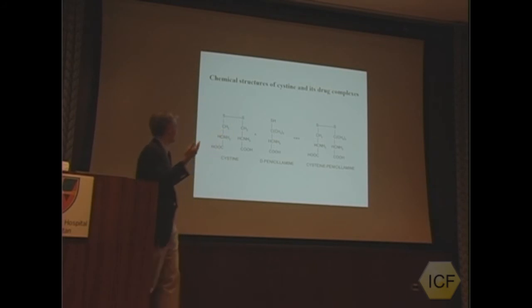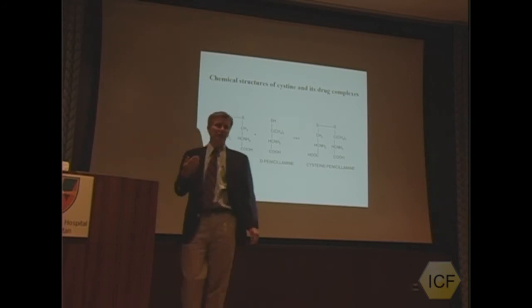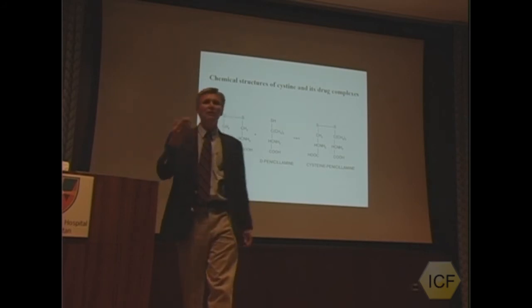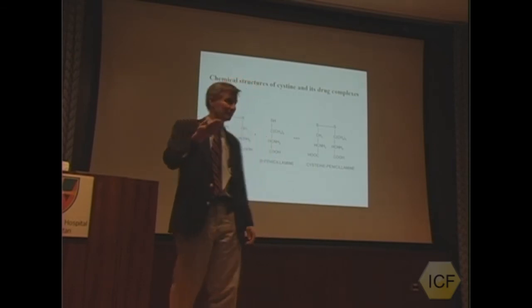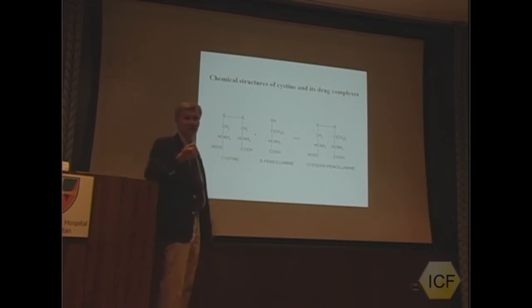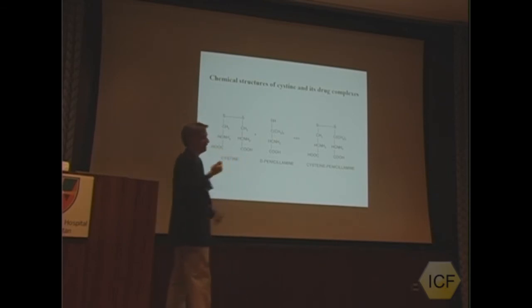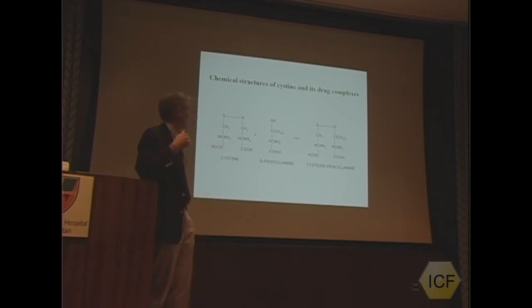You think, well, why are you telling me this? Because if you're measuring the amount of sulfur reactivity in the urine, the drugs have sulfur reactivity. And if that's how your lab measures cystine, there's nothing wrong with that, but you will not get an accurate cystine measurement in the presence of these drugs. So it's quite complex as to how you want to follow therapy.